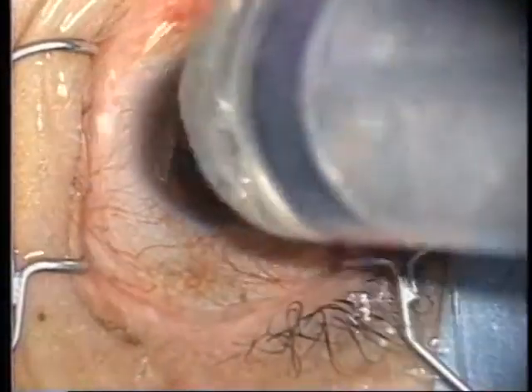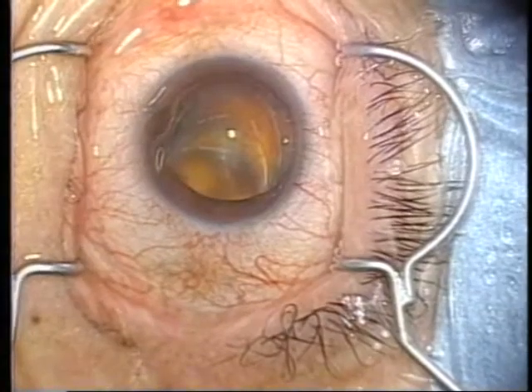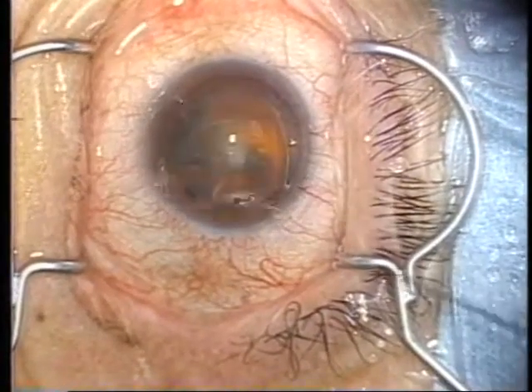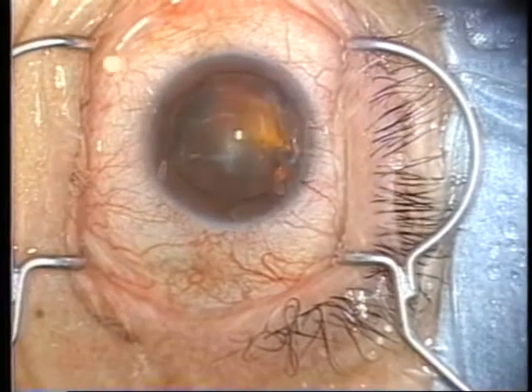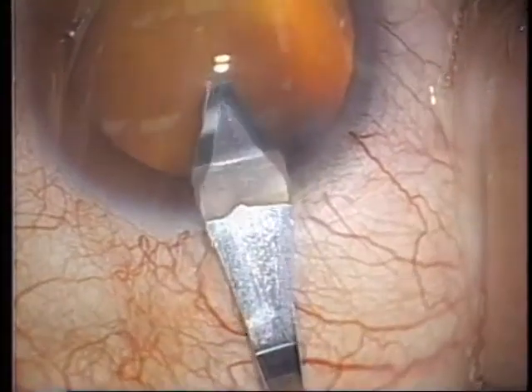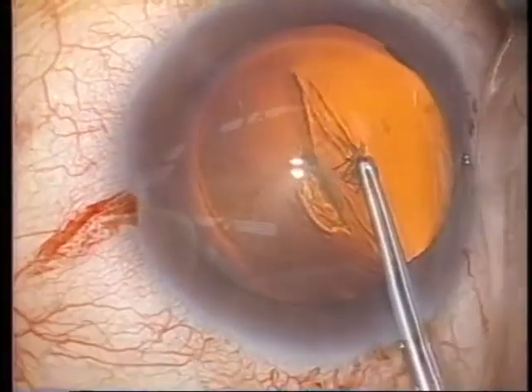Viscote will be so firmly fixed to the cornea that it cannot be easily washed off. The part washed with perfusate is temporarily depressed, but immediately becomes uniform again. The visibility of the anterior capsule will be maintained without dropping perfusate onto the cornea throughout the surgery.